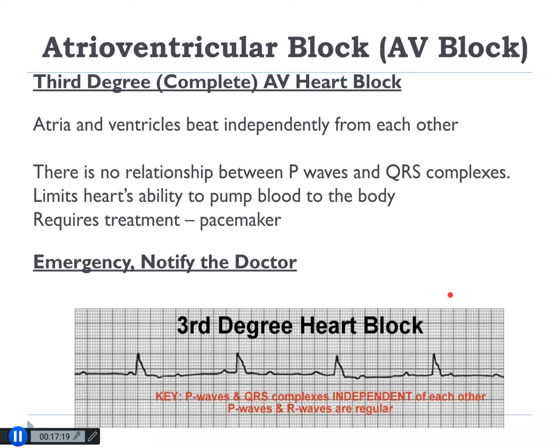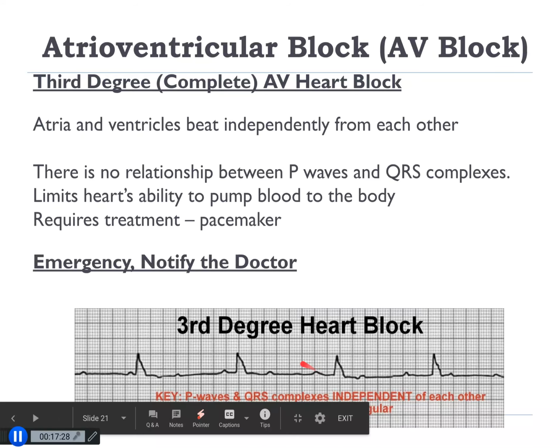So the P waves and QRS complexes are totally independent of each other, but they can be regular. But you have a P wave here with no QRS, another one here.